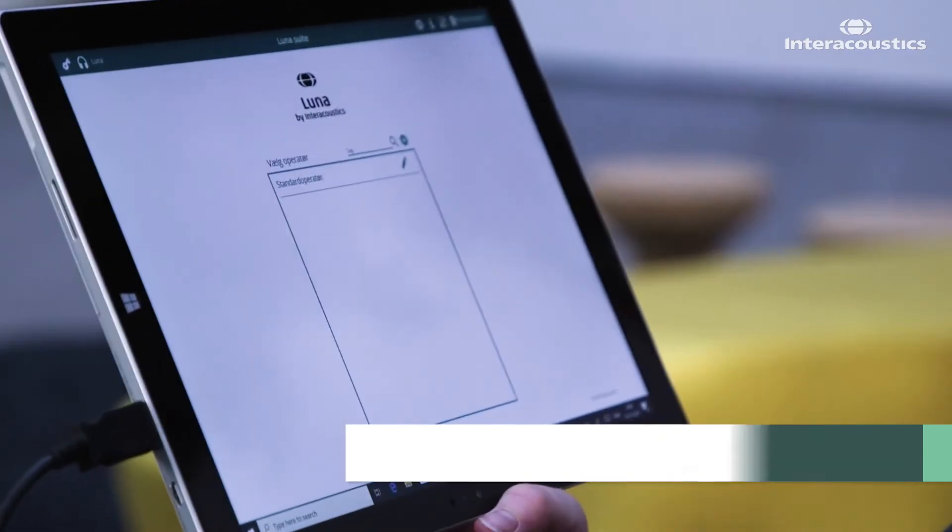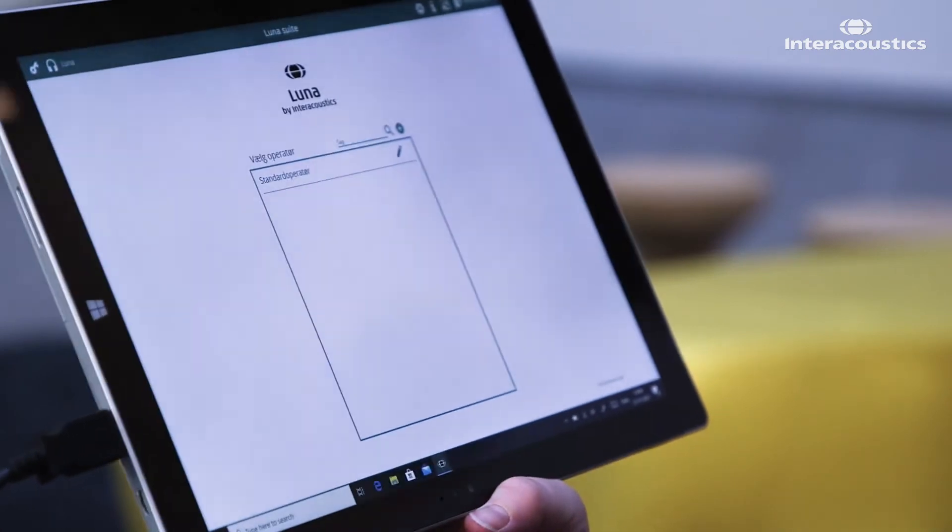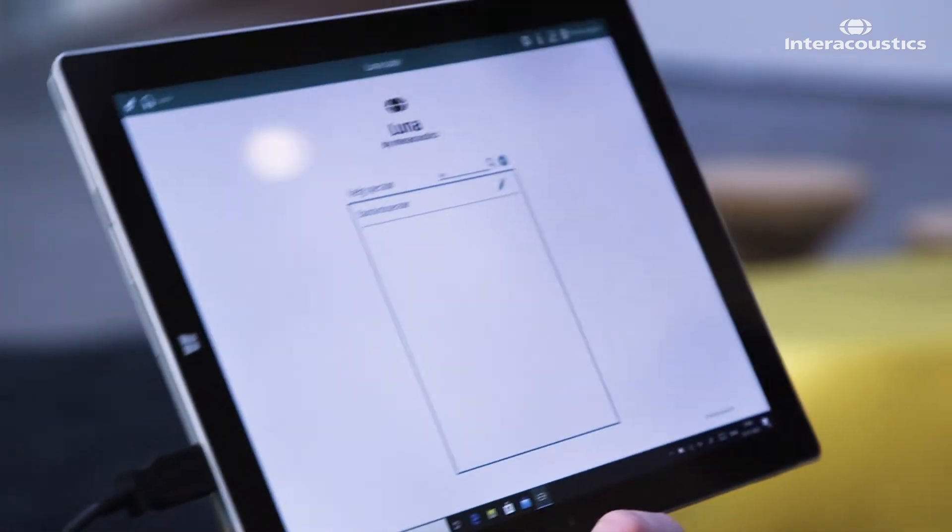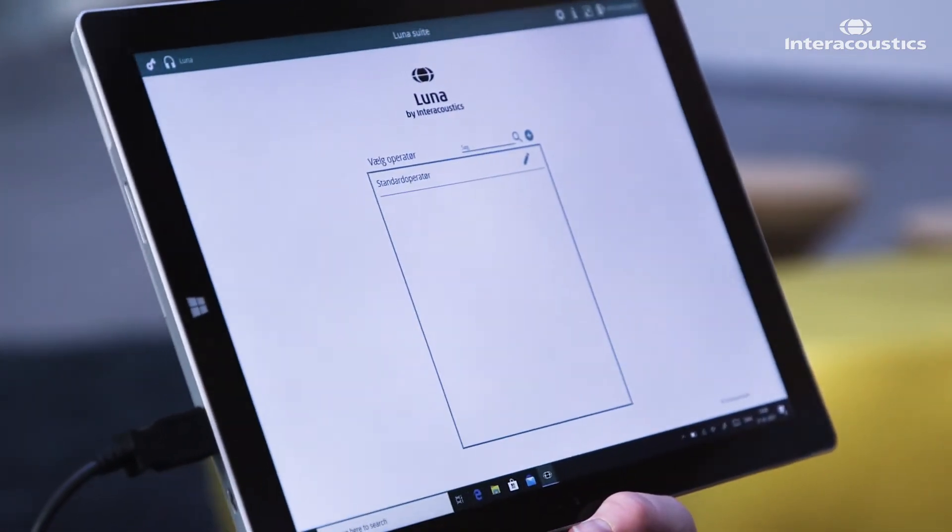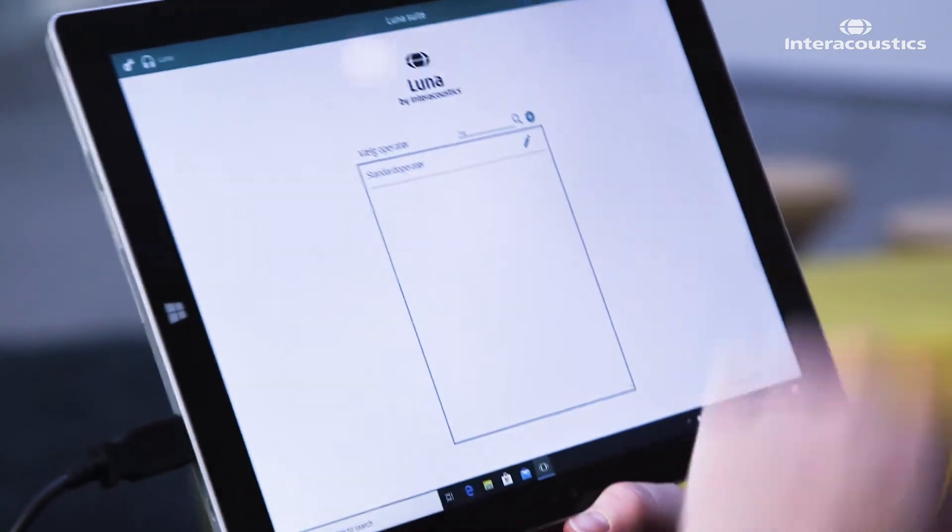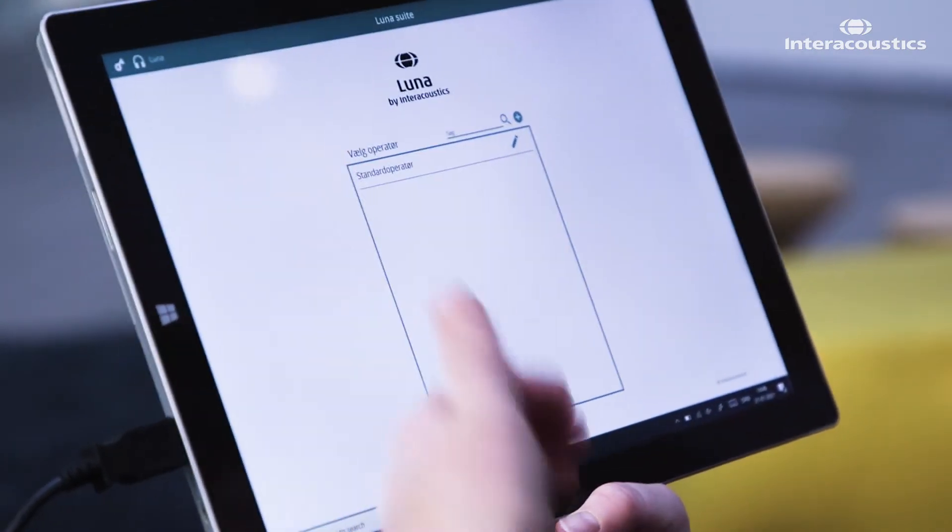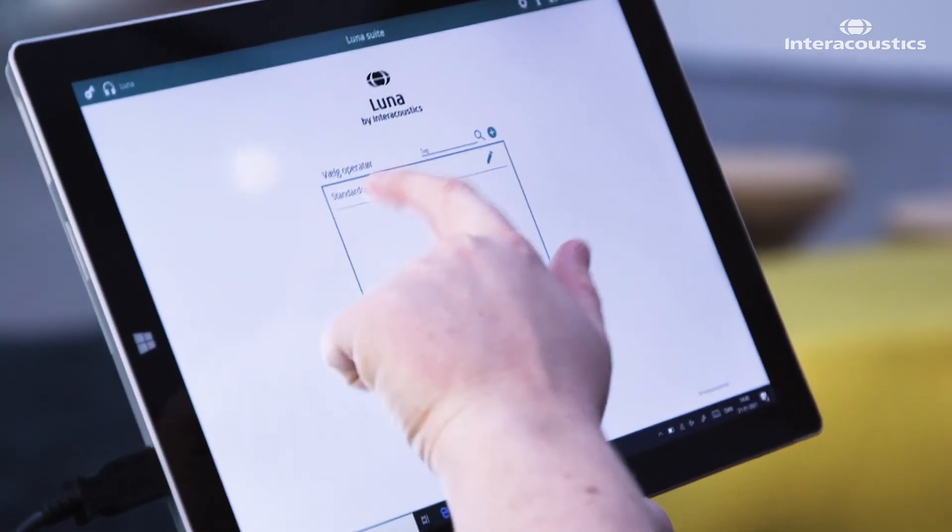The Luna Suite consists of the various options of operators that can run the system. You can add an additional operator to it or you can select one from the list.